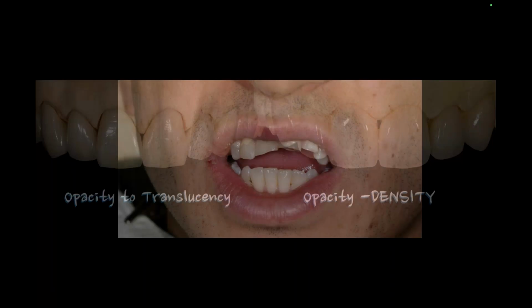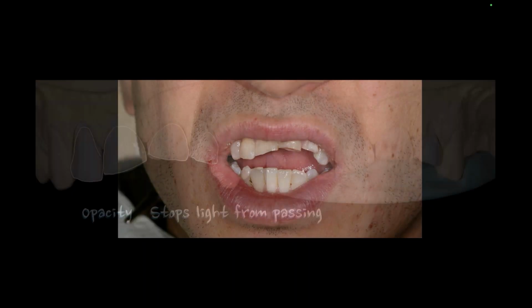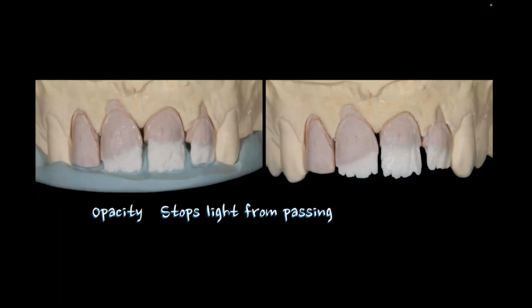And there are times when I have no choice but to incorporate opacity, like in a case like this where someone had an accident, they broke their teeth, and I have to fill space. When I have to fill all this space, I know right off the bat I need opacity. And to be honest with you, some of the opacity that I need, I'm not going to get out of a normal powder. I may have to modify my opacious powders.